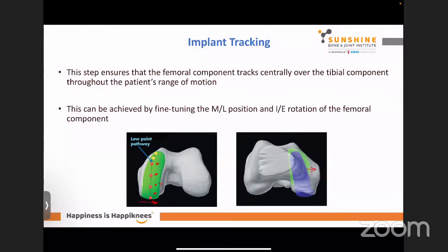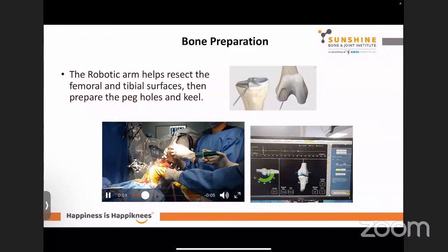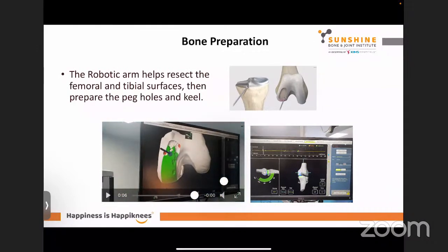So this is ways to improve your implant tracking with the robotic cases. Then of course, there's the bone preparation. The robotic arm helps to resect the femur and tibial surfaces within your haptic boundary. So this is what it looks like. While I'm burring away, I'm looking at the screen. The burr helps me to make sure that I'm not going outside my haptic boundaries and I'm very safe.